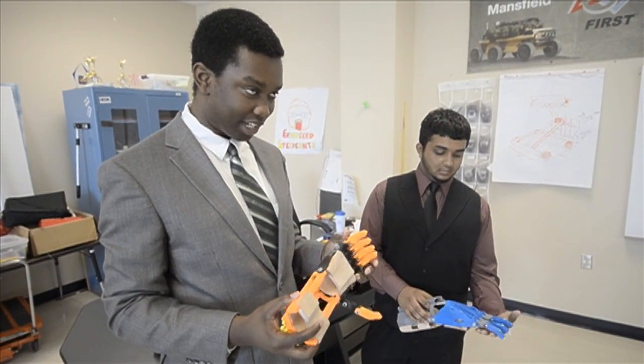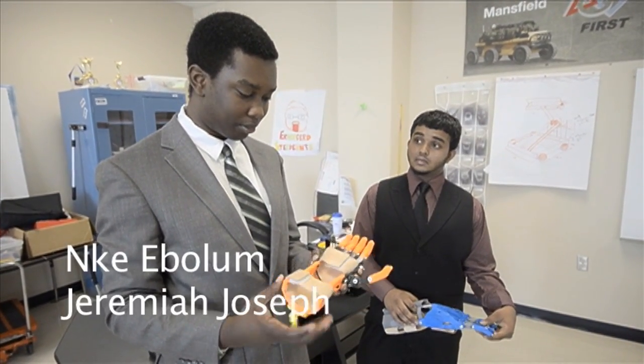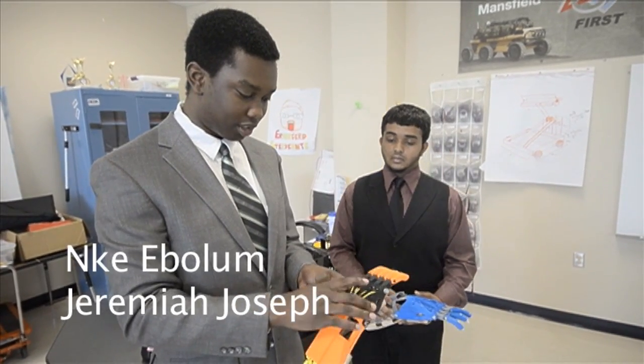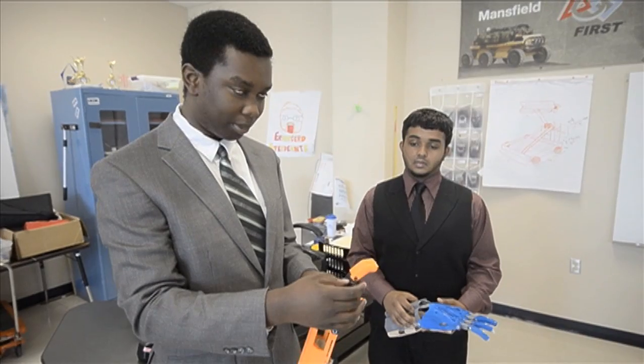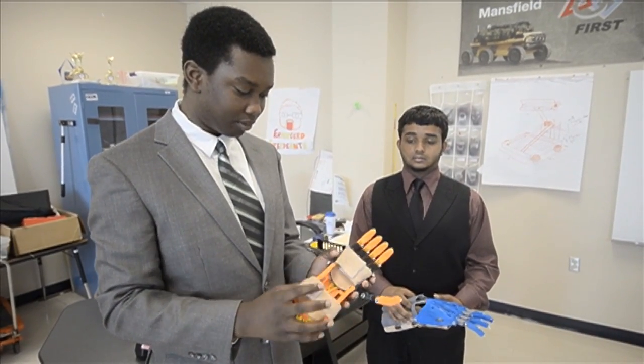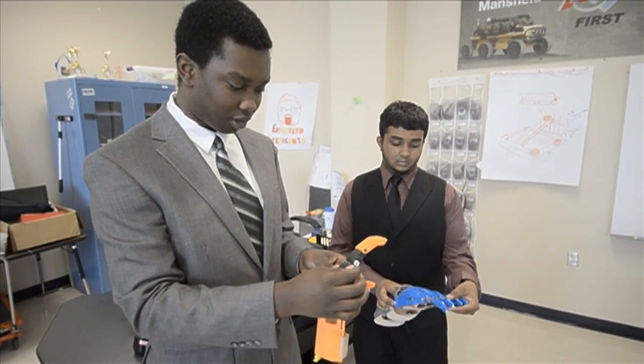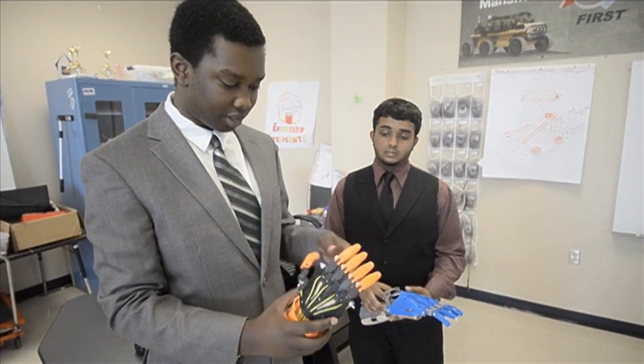Each part — it depends on the size of it because we use the 3D printer to print out most of the parts. This one took a couple of hours, and the fingers usually take a couple of minutes to print out. Then once we print them out we assemble them — we put our nuts and bolts and the axle in so that way these things can bend.